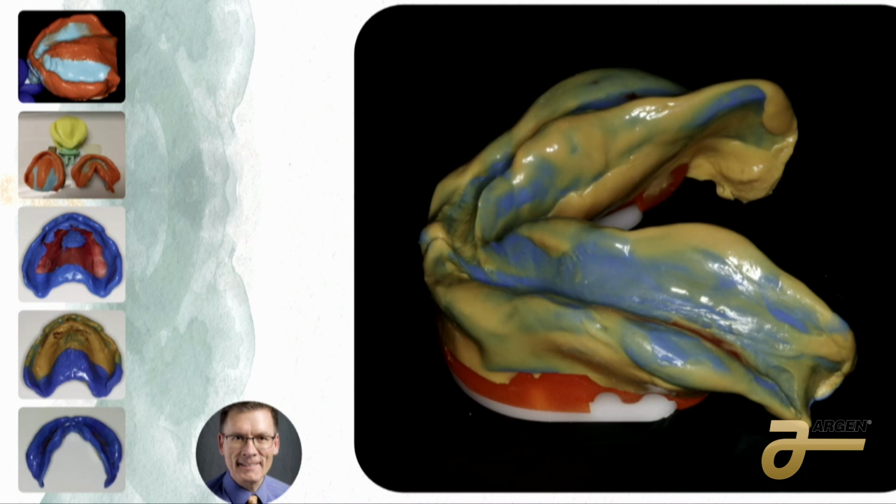Now, I know I've spoken to a lot of people who say, well, I want fully digital dentures. I'm like, this is still 95% digital. We're just doing a final impression. We can still do the custom tray digitally. You can even take a preliminary intraoral scan in some cases, but the final impressions should still be a final impression.